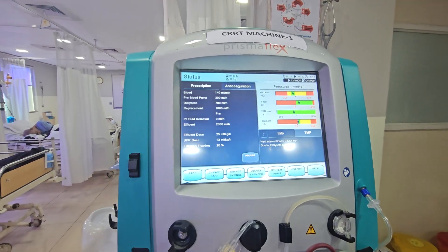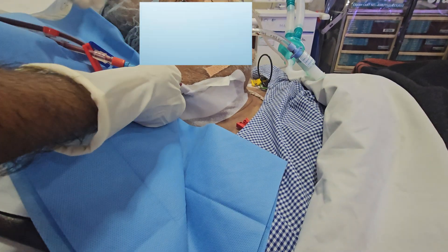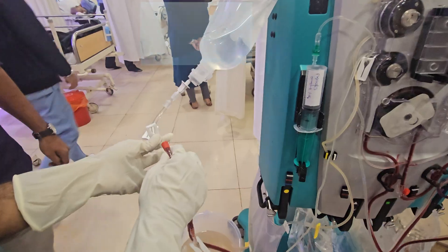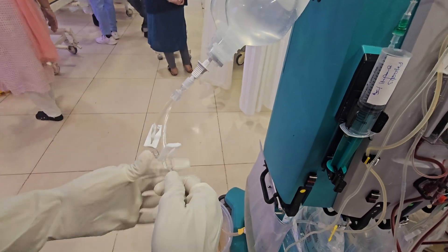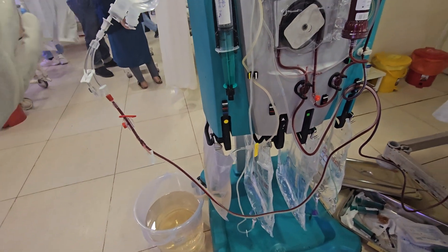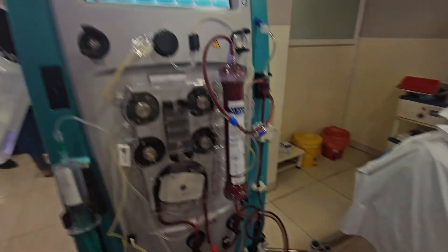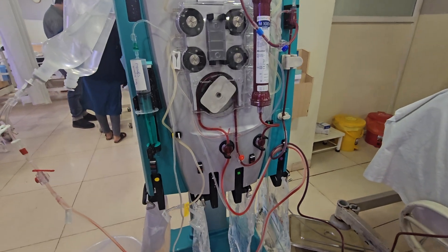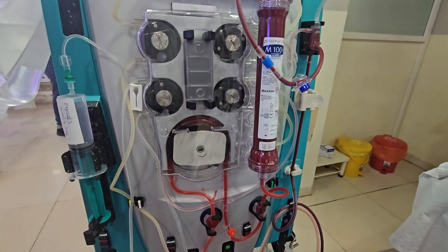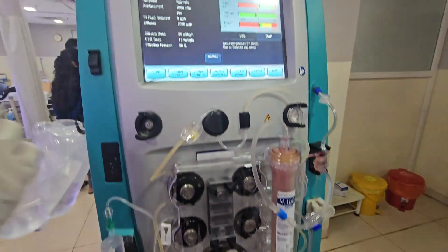Now, how to end CRRT. Press Stop. Red access line is removed and connected to the priming bottle. Press Resume — it will return the blood to the patient. Once done, press Stop.